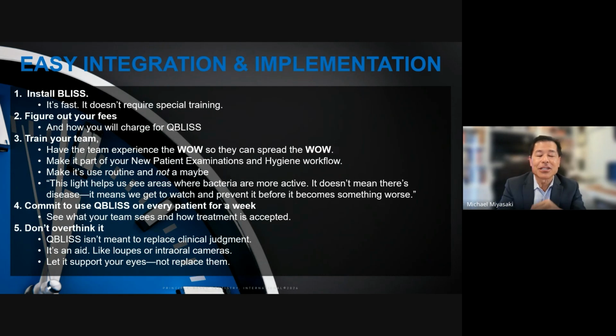Use it on every patient, and then look back after a week and ask your team, so did it make a difference? And I think it's going to make a difference. When you think about it from a common sense point of view, how would it not make a difference in your practice? And then don't overthink it. Like, I know I have doctors that, again, I mentioned earlier, they worry about the colors that they see. What does it mean?